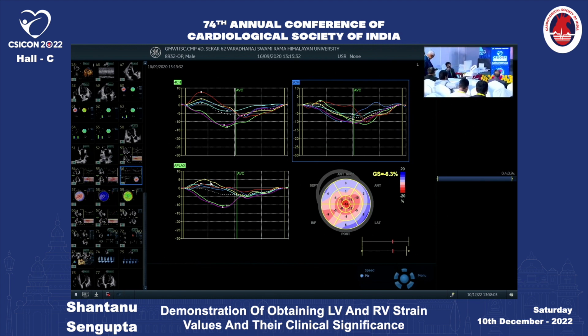Good afternoon, sir. I have a question to ask you. Do we have to select a number of loop beats while we are doing the strain, or just one beat? I think they recommend acquiring 3 beats and taking the best beat. With a single beat, we have seen that subsequent post processing, if the things are not taken very well, can have problems. What is your opinion? We can do it in a single beat also.